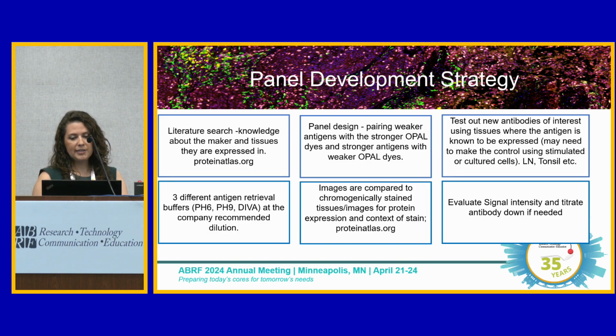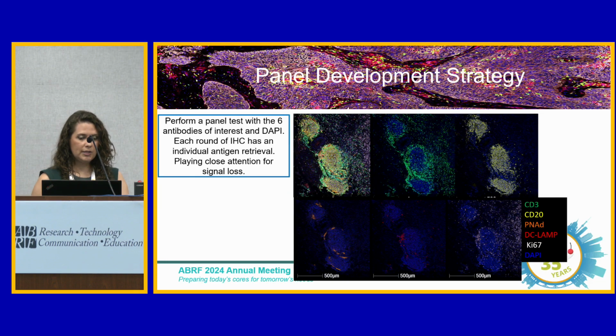Finally, we evaluate for signal intensity and then titrate the antibody down if needed. But this is usually the case when you're using Opal dyes because there's some amplification step, and so more likely than not, you'll be titrating that antibody down.